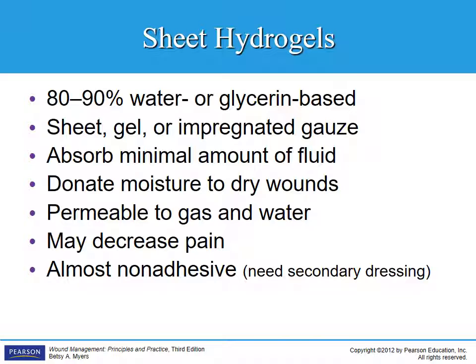It may decrease the pain. Again, think about a dry wound. If I put something on top of it that gives it a little bit of moisture, it's going to decrease the pain of that wound bed. It's almost non-adhesive, meaning 9 times out of 10 it won't adhere to the wound bed. But you will need a secondary dressing over the top of it.